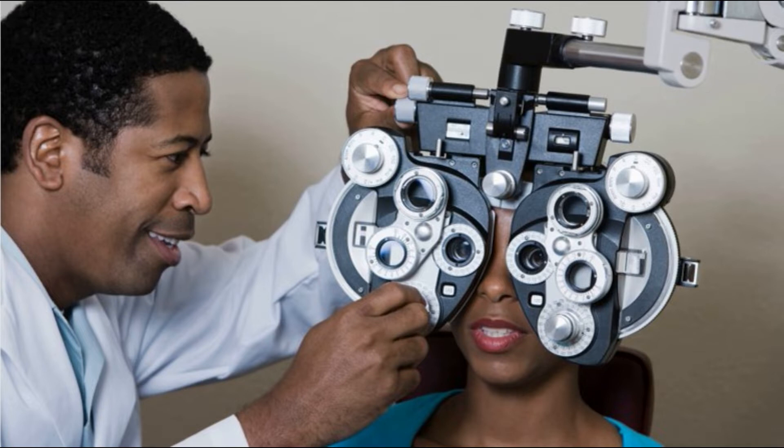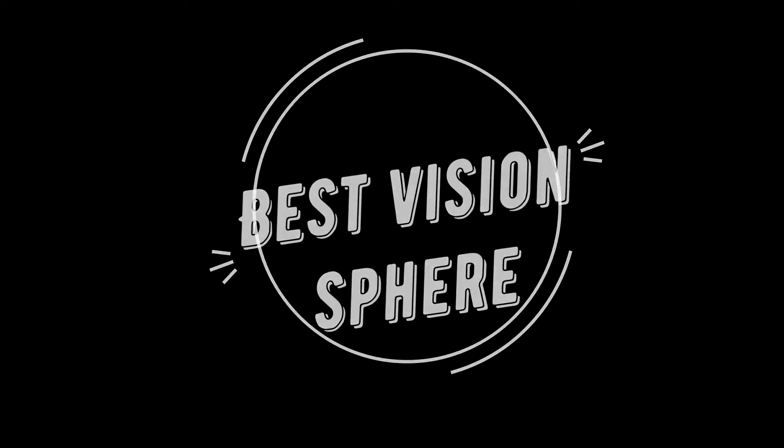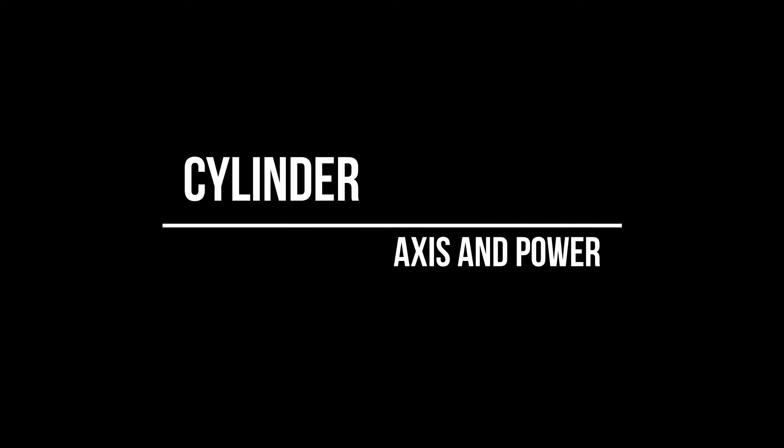In this specific video today, we will focus on how to get the best sphere in subjective refraction. In the second video, we will discuss how to check if a patient really needs a cylinder and how to fine-tune both the axis and the power of the cylinder.